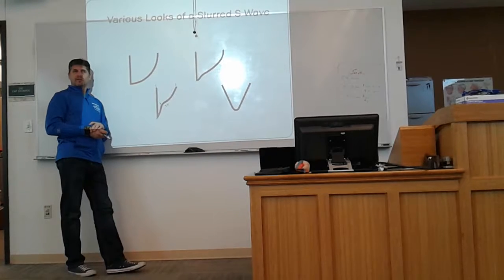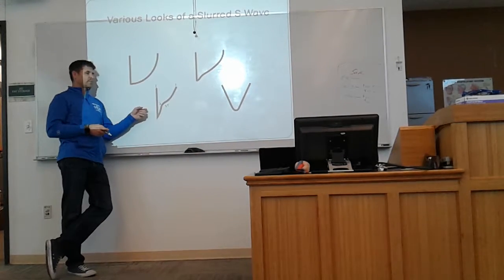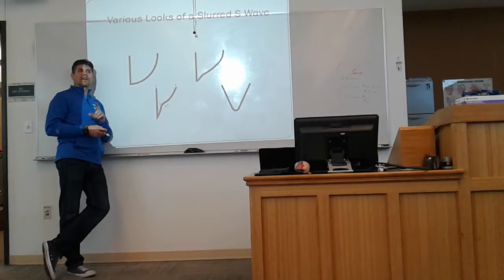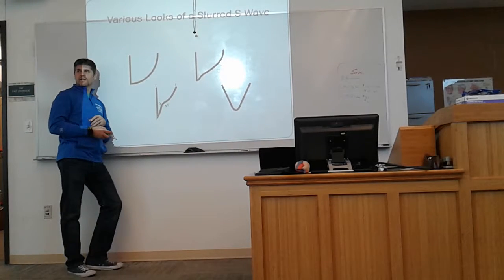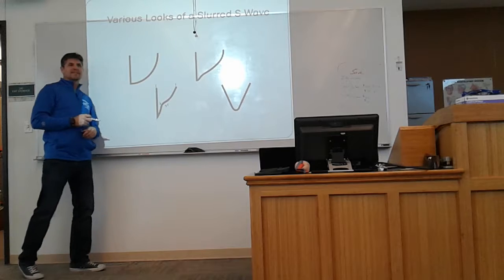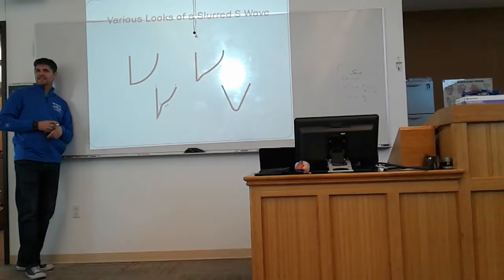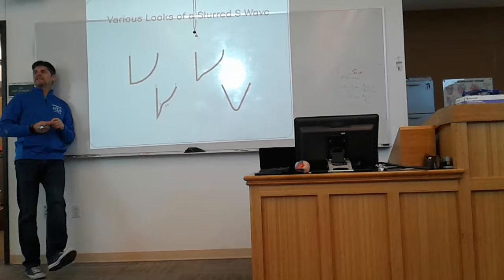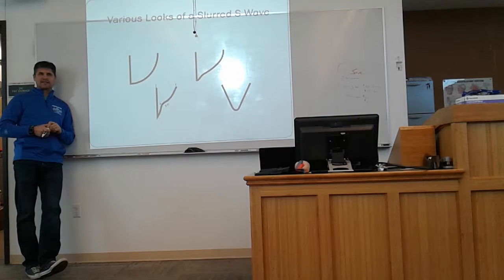Okay, I want to change your thought process. ST depression will never show you reciprocal ST elevation. ST elevation might show you reciprocal ST depression. We haven't talked about that yet, but that's important. You cannot have ST elevation in a reciprocal lead if you see ST depression. ST depression does not cause elevation, but elevation causes depression. ST depression will never cause a reciprocal ST elevation. ST elevation can cause a reciprocal ST depression. It doesn't matter what the lead is.